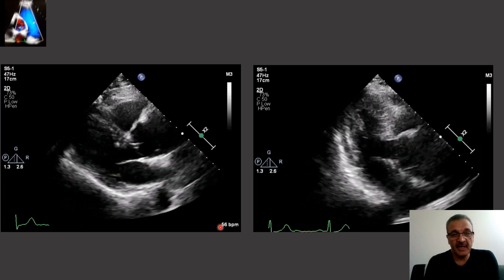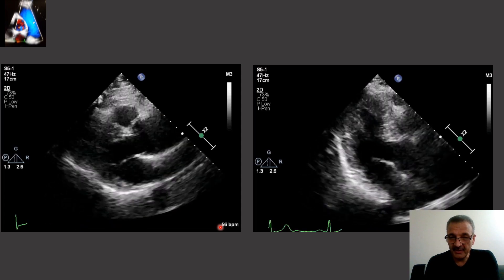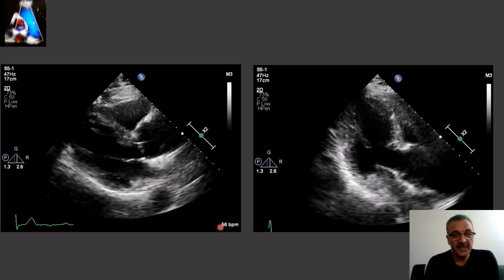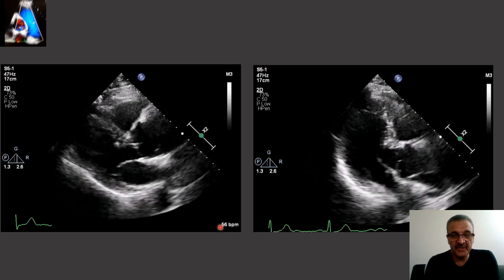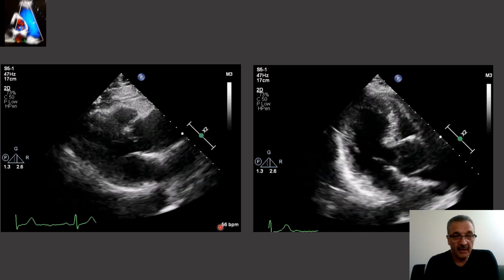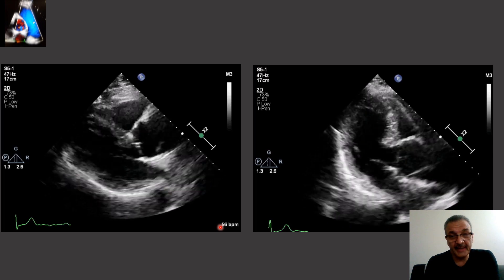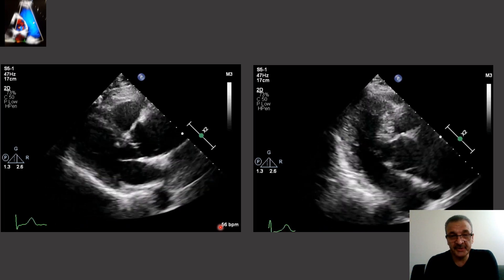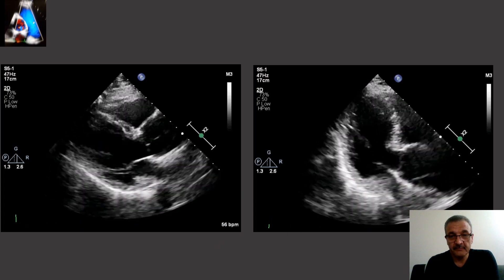I'm going to present some cases. Use your knowledge and guess what it is. Here we have one patient with a little chest pain, pressure on chest, 55 years old, and we get this parasternal and apical four-chamber view.